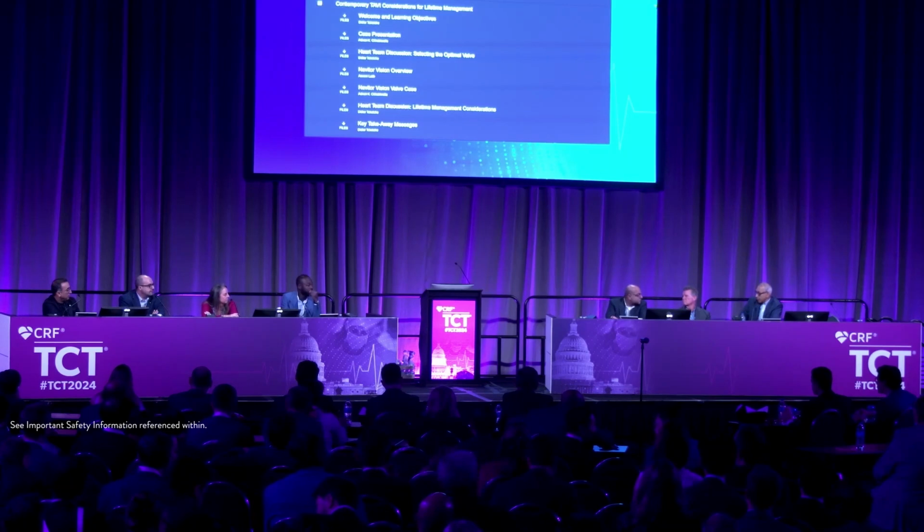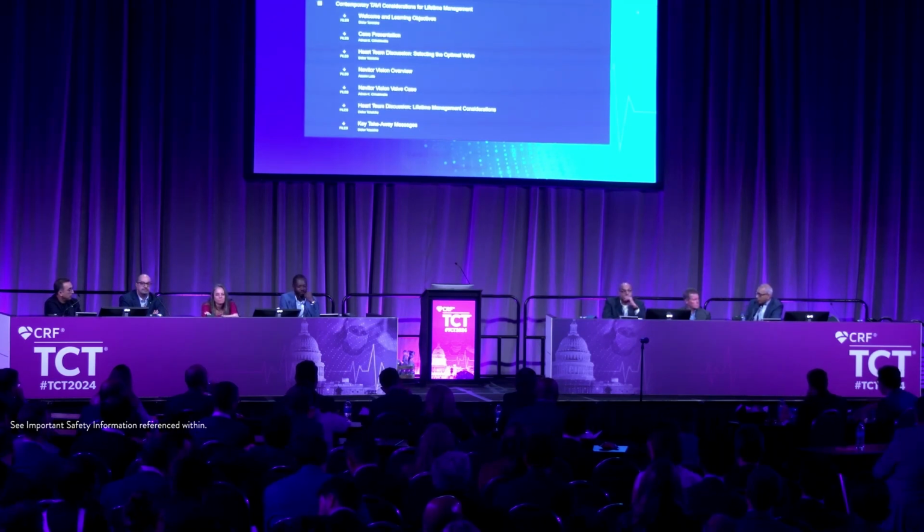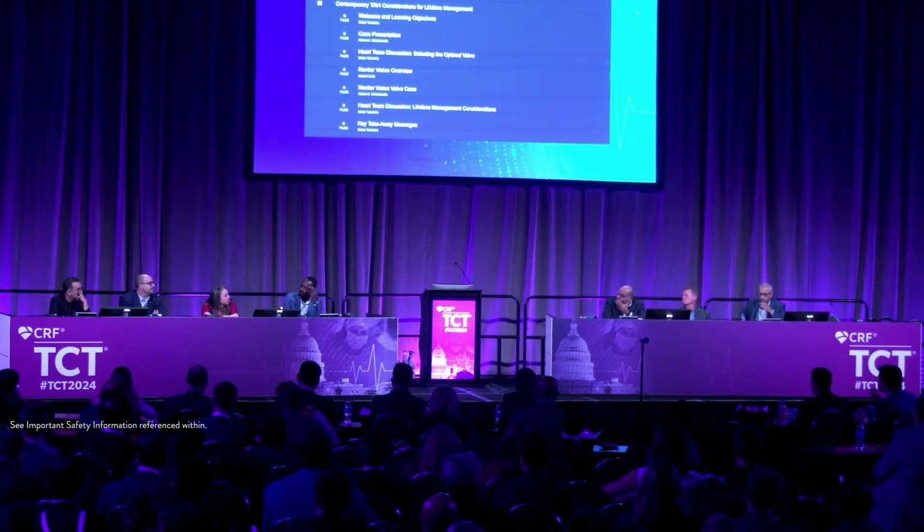Yeah, that's exactly, Azeem, that's our exact pathway: are you a TAVR candidate first? And if you're not, would we operate? And the answer is that we probably would operate on him. So let me ask Modi, do you think that this patient is, for any kind of reason, a good candidate for TAVI or TAVR?